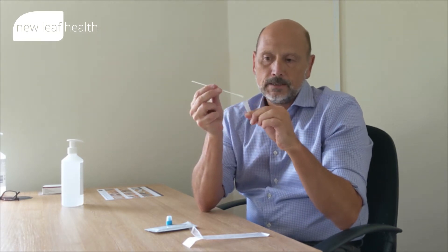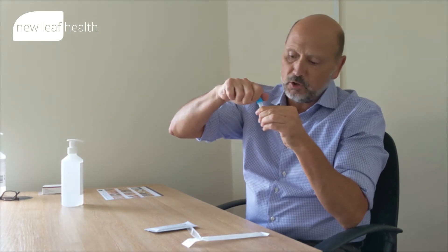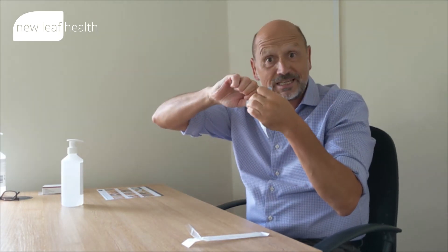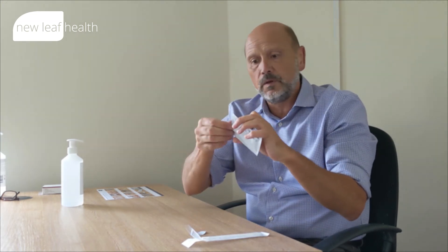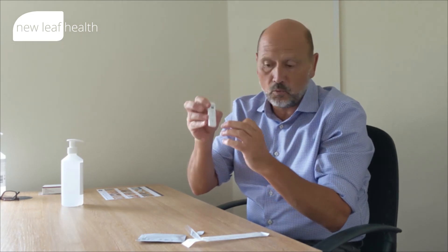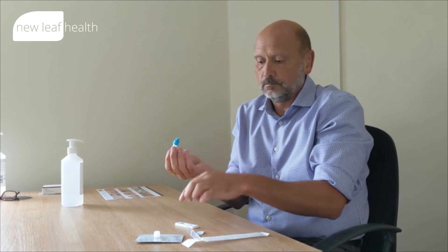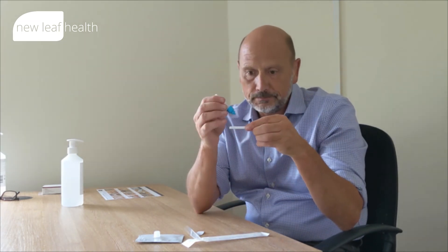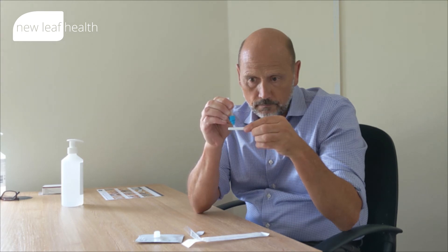So this is my early morning test. Put the cap back on. Once the cap's on, just open up your test cassette — save opening it until you're ready to put the specimen on. We're just going to target the sample well. Unscrew the lid, invert, and squeeze in four drops: one, two, three, four.